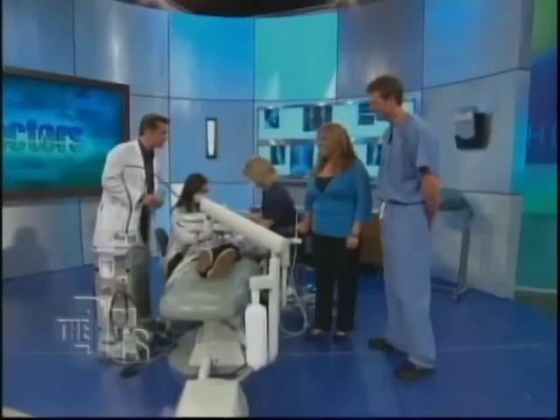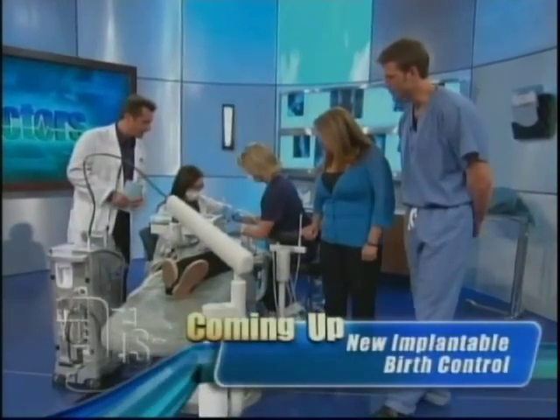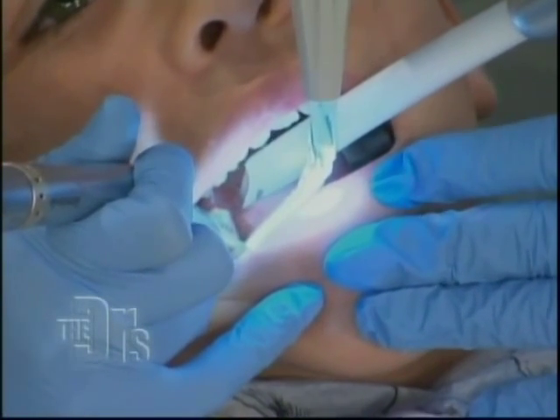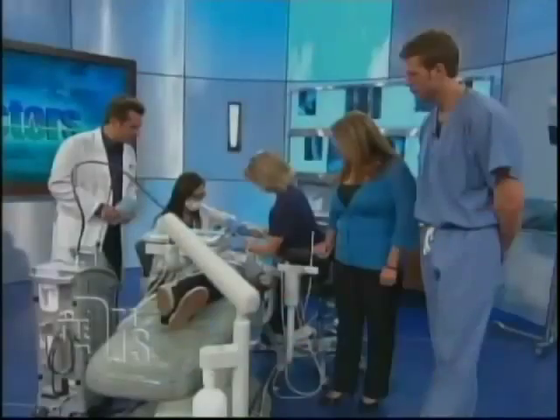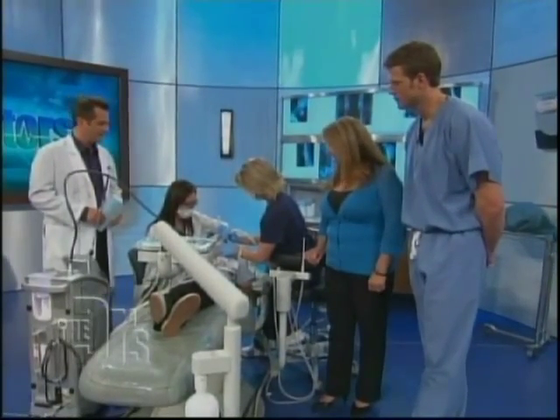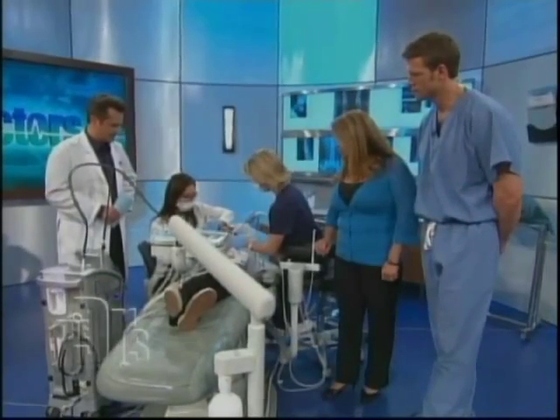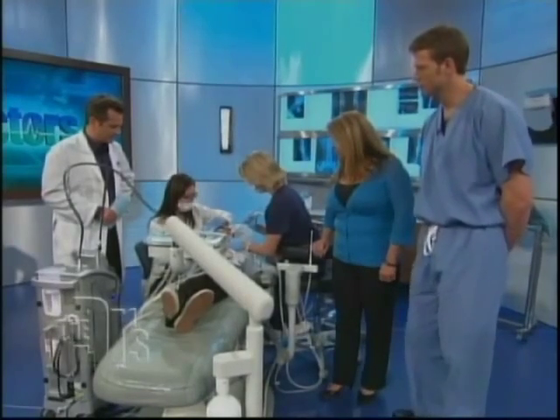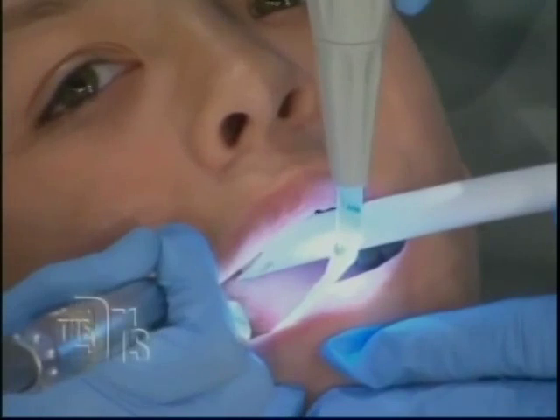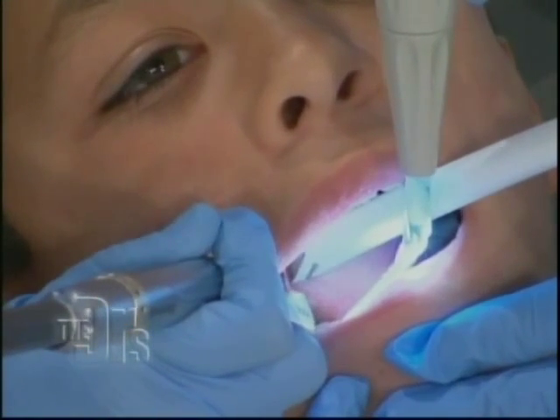So you're actually doing the drilling right now? Yeah. We just put our patients down and get started. Zach, I'm going to use my water gun to take out all the decay, which are the sugar bugs that eat your tooth. The sugar bugs — which is the plaque and the bacteria on your tooth — is like a glitchy type of material. Because of this, there's a lot of infection in the tooth, and eventually, if you just leave the decay there, which happens to a lot of patients because they're so scared to come to the office, they end up needing a root canal, which you don't want.